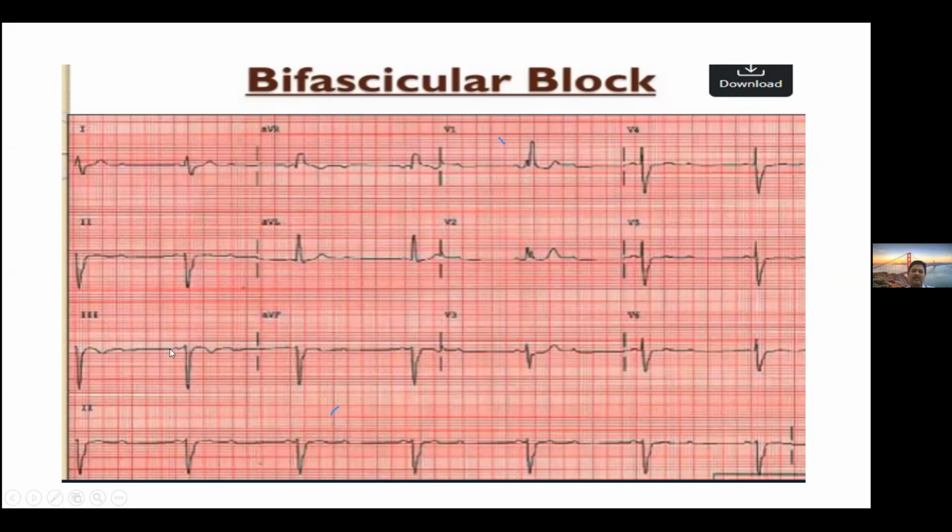The same ECG with a prolonged PR interval, you are calling it trifascicular block. It means that it is an advanced conduction abnormality. So impending complete heart block is there. So the patient is likely to go into complete heart block very quickly. We have to intervene very properly.